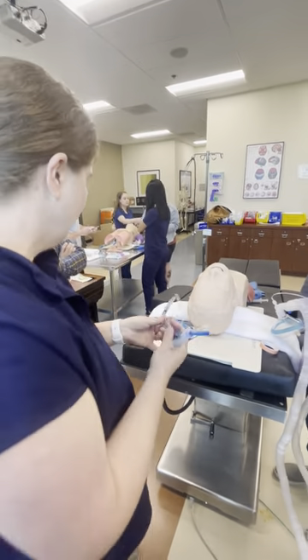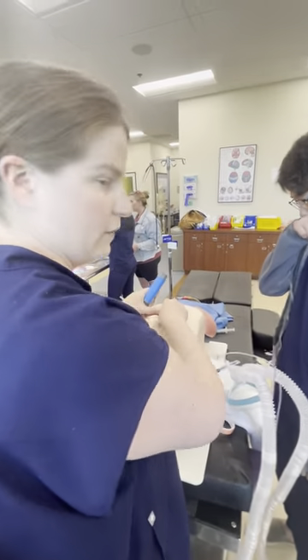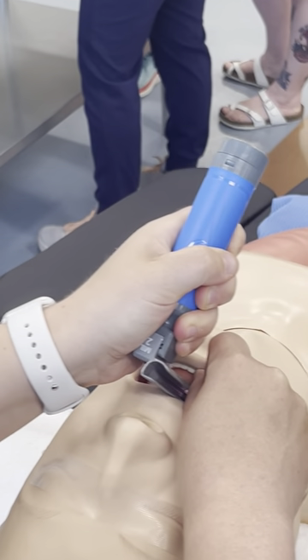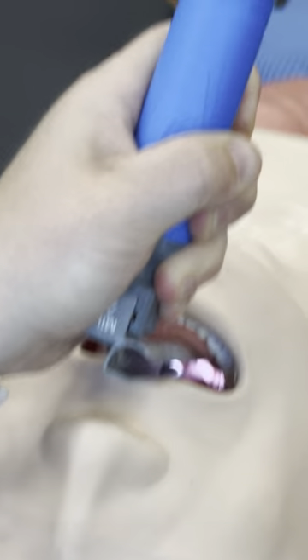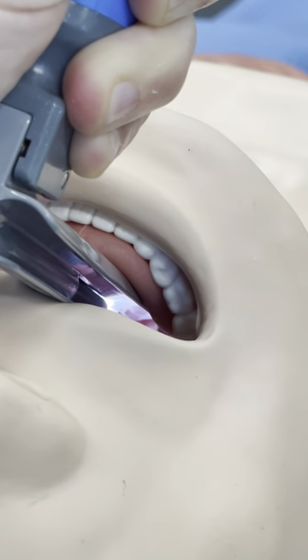You should always be listening. He's trying to see the tube go through the cords. There is my view — if you want to zoom in. I'm trying to see the arytenoids; you have to go in a little bit further. There — okay, yeah. So that's your view of the cords using a Miller blade. I would call that a grade two view.